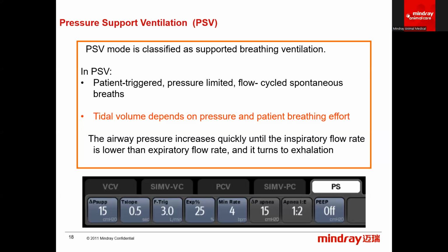So you have a spontaneous trigger and a spontaneous cycle. So it's patient triggered, like I said, the pressure is limited and we're flow cycled with our breath. So our tidal volume is going to depend on our patient's airway pressure as well as their breathing effort.